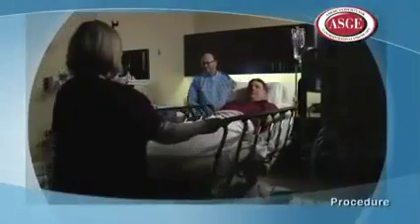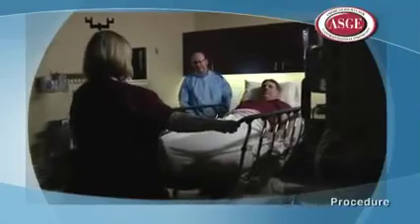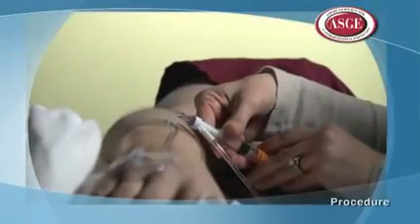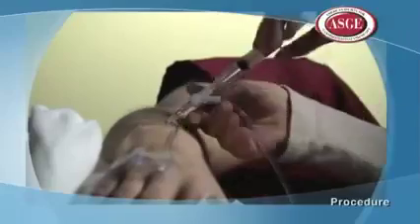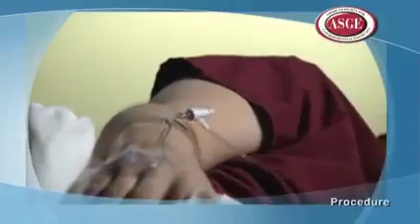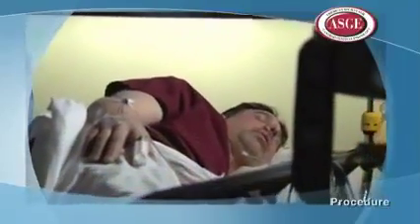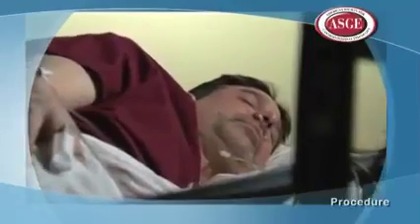Colonoscopy is done in a procedure room equipped with a colonoscope and a TV screen that shows your doctor the images from inside your colon. Before the exam, you'll have a needle placed into a vein in your arm in order to give you the sedation to make you sleepy, as well as any other medications you might need. This will make you comfortable throughout the entire exam. Many patients may fall asleep completely and may not remember anything about the exam.